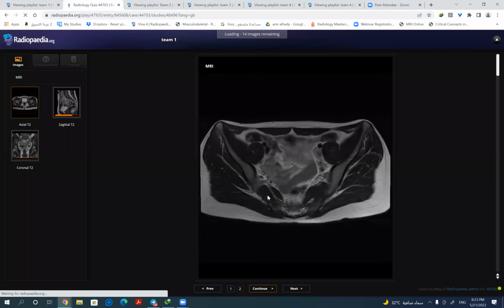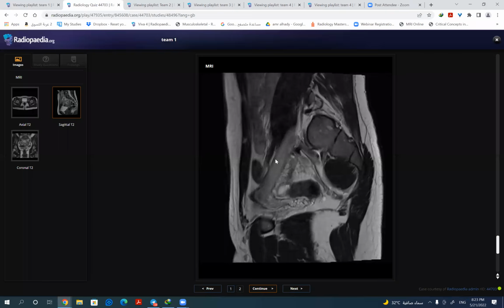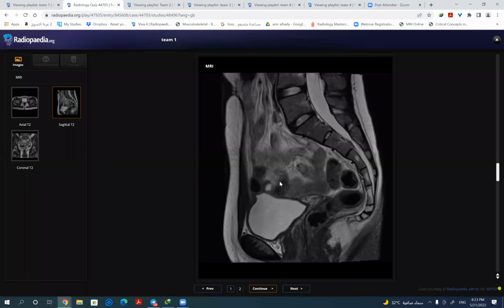And this, what I mean by other Mullerian duct anomaly, the only question I ask you, is just as simple as uterine didelphys, bicornuate, unicornuate. Yeah. That's what I mean, yes. Yeah. I forgot.